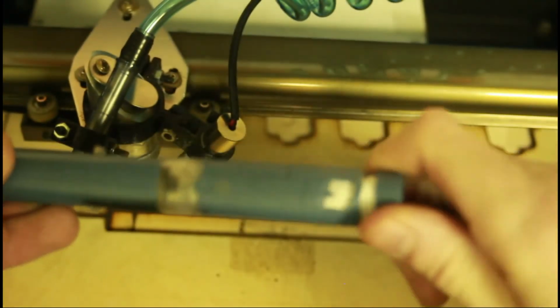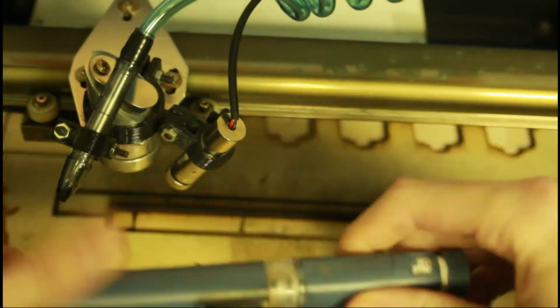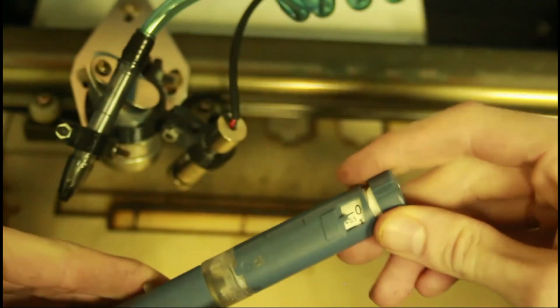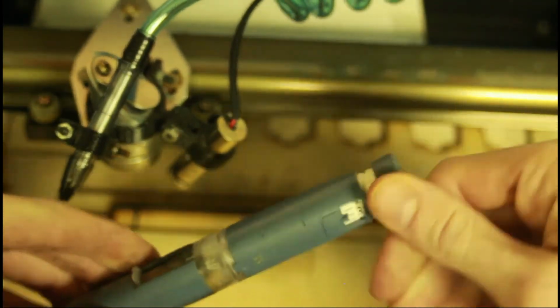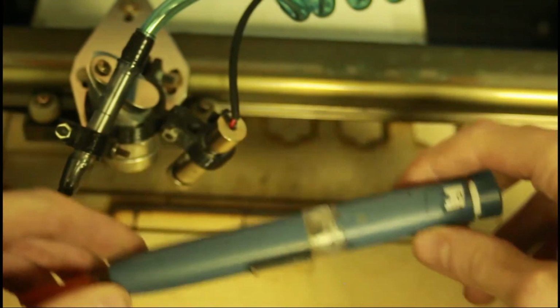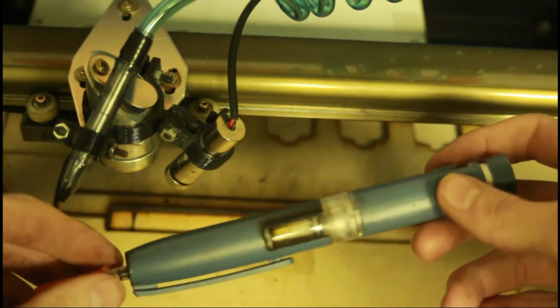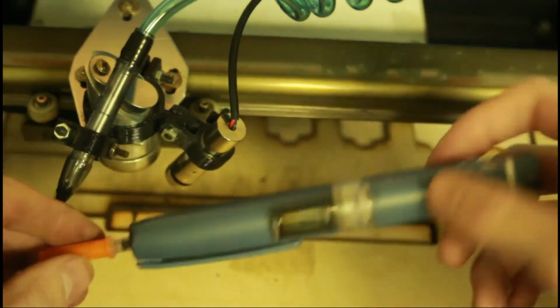Now, these ones with the half units, I'll probably sell for a premium. Again, thank you, Megan, for bringing these to me, because they are cool. They're a bit more useful. You can do 1/20th of a unit rather than just 1/10 of a unit with the gray ones. But either way, these are an awesome invention. If you like one, I would be glad to give one to you.